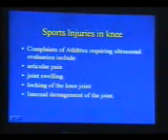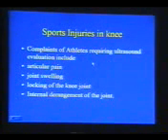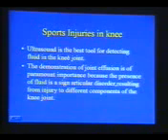Then we come to sport injuries in the knee. The complaints of athletes requiring ultrasound evaluation include articular pain, joint swelling, locking of the knee joint, and internal derangement of the joint. Ultrasound is the best tool for detecting fluid in the knee joint. The demonstration of joint effusion is of paramount importance because the presence of fluid is a sign of articular disorder resulting from injury to different components of the knee joint.